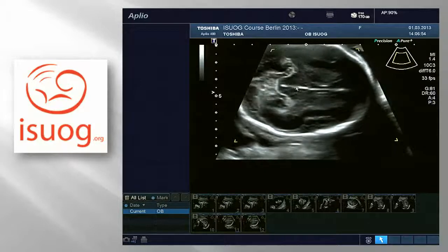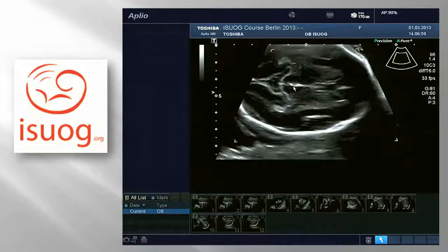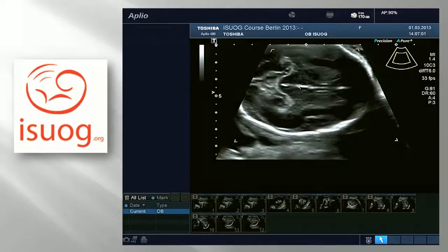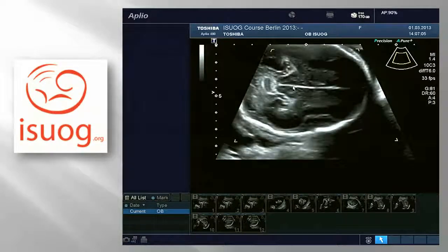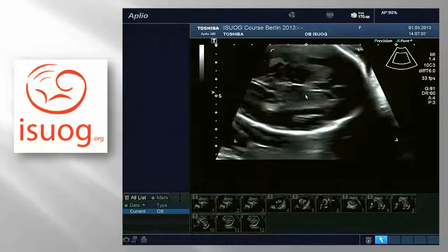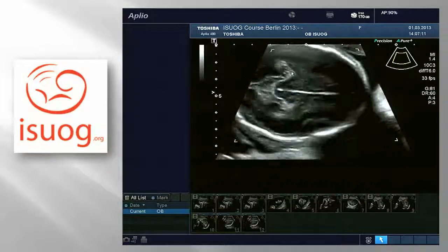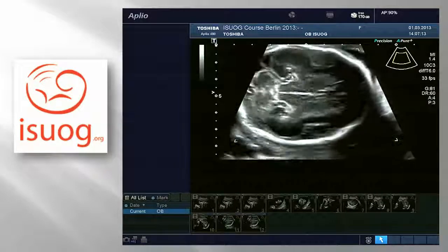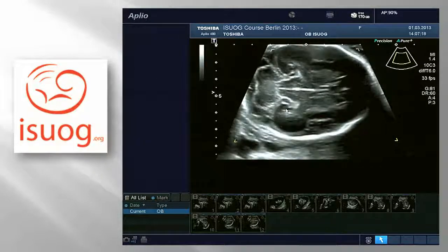Third ventricle, right there, is a bit complex. There is the massa commissuralis right there, which is decreasing the bulging inside. It's from here to there. Thalami, internal capsule. The hippocampus right there, important structure, been mentioned before, with the quadrigeminal cistern here and the hippocampus there.